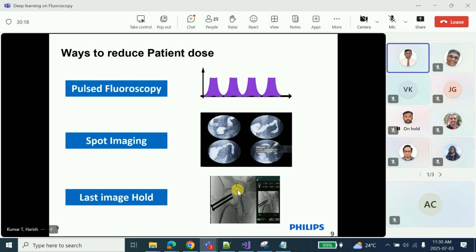When you ask about the urinary system, what angle you have to cover? Kidney you have to put, ureters and bladder. Including nephrology, then again from blood to whatever contrast that you give, they are already opaque. They don't allow X-rays to pass through. That's why you're able to appreciate any abnormalities within that contrast region. Translucent is when it allows the radiation to pass. So these are the terminologies. So they are radio opaque.